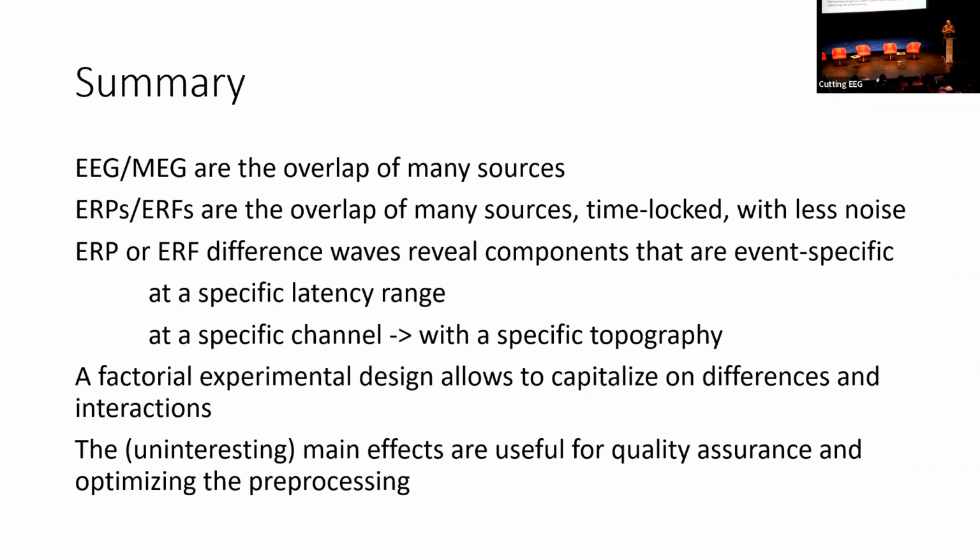So if you plot the event-related potential, and if you plot the standard deviation over trials, you might actually see that the standard deviation is larger at the peak of the ERP components than it is in the baseline. If that is the case, then there's a clear indication that there's variance over trials. And of course, then you can also start asking the question, what does this variance over trials mean? And that's where you need single trial analysis strategies, such as decoding strategies, where you can relate the activity in each single trial to, for example, some behavioral metric that you have, like response time or visual perception thresholds, like a visual perception that changes over time, over trials.